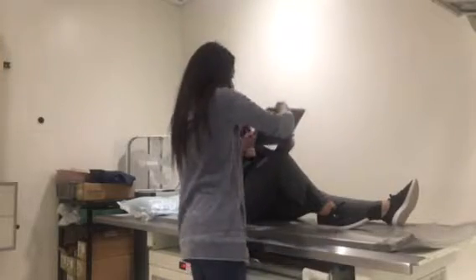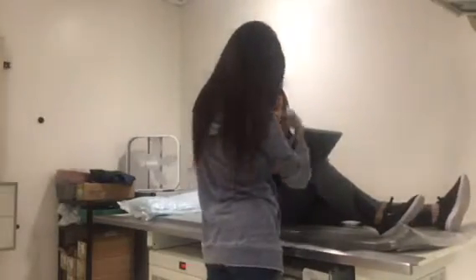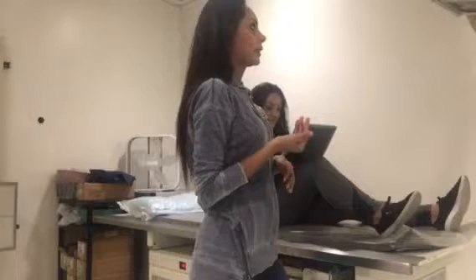No? Okay. So probably just sit. Okay. This is the farthest. And then, actually, can I have you come all the way down to the table? Okay, right there is good. And I'm going to have a tube angle about 15 to 20 depending on my leg flexion.